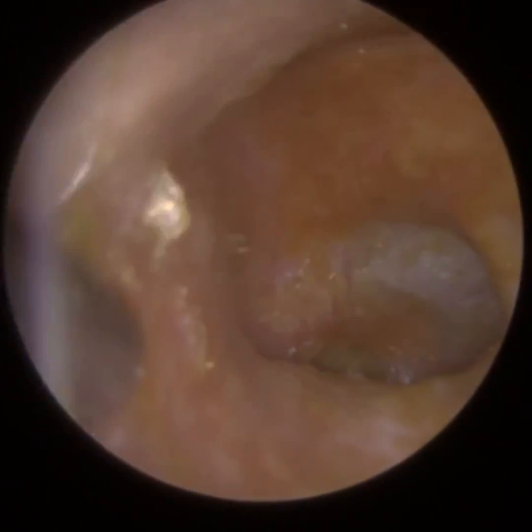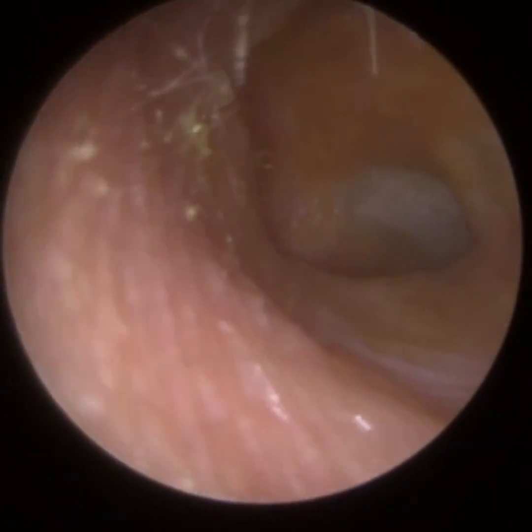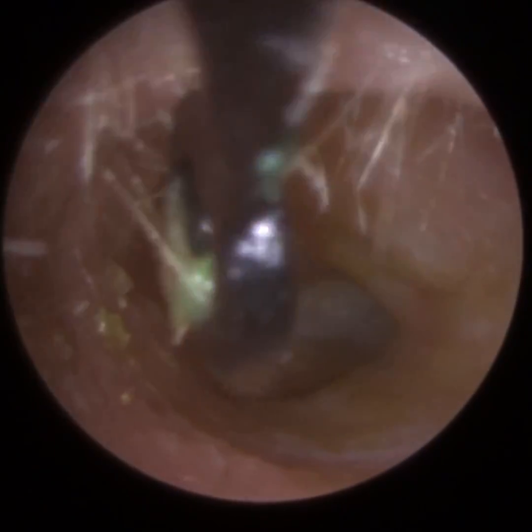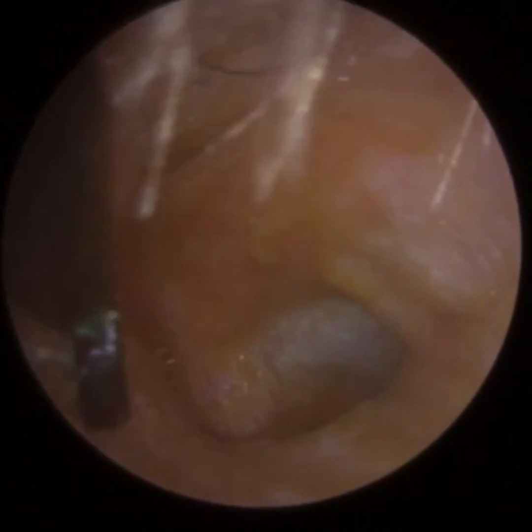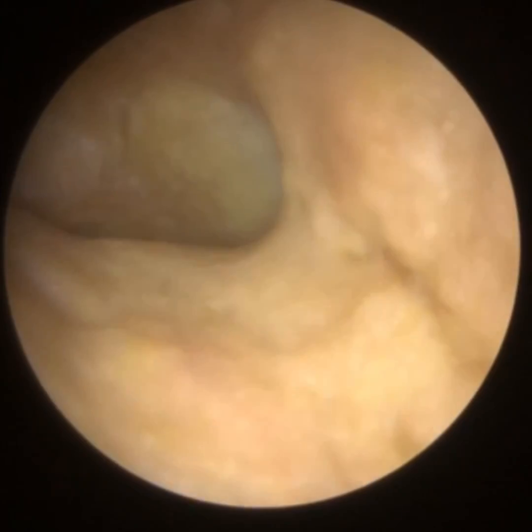Some of you may be wondering, why don't you just flush it out? No, with using an irrigation or syringe method, when you've got an infection, we don't, in the UK, syringing and irrigation, GPs, doctors say just stop performing that completely now, more or less. The gold standard here is suction, so there's more inherent risks. With irrigation, you're more likely to develop tinnitus, infection, and also when you've got an infection already, you do not irrigate the ear, you're just going to make it worse.